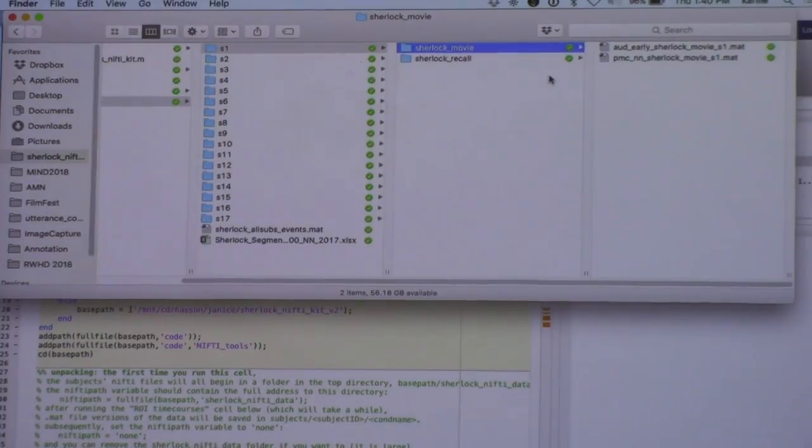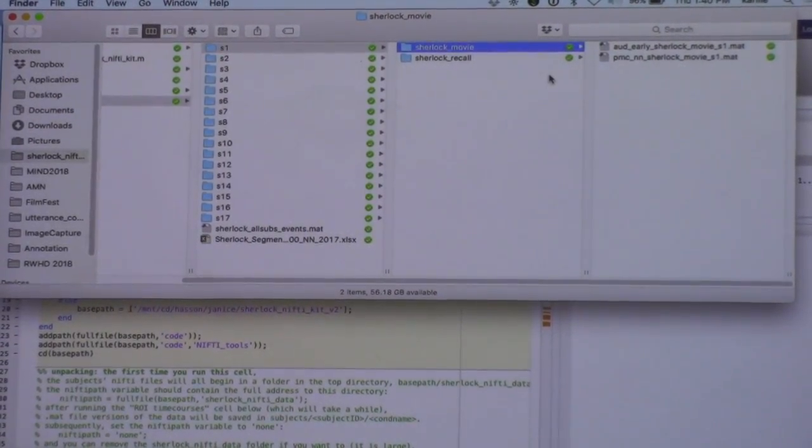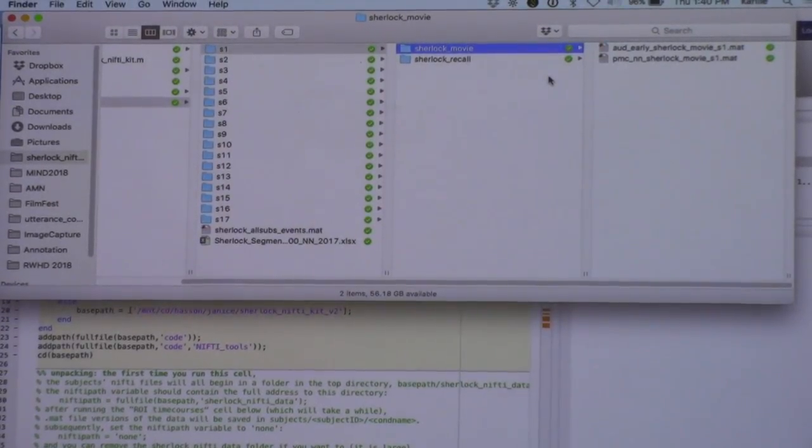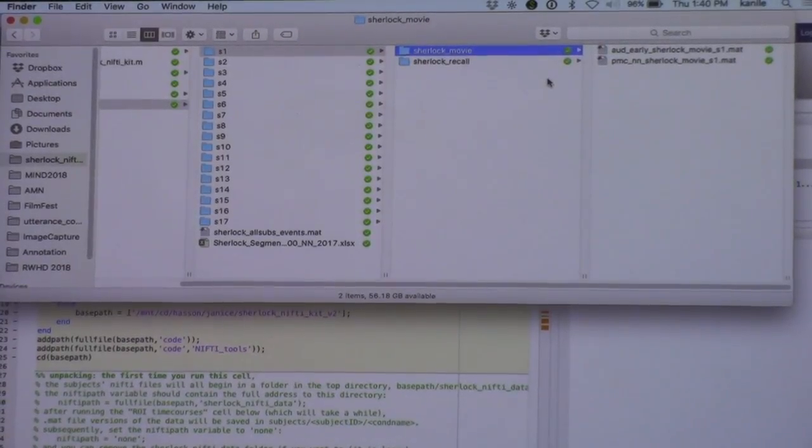All from the HRF, right? All subjects are shifted 3 TRs to account for the HRF. And the way that we determine that, 3 TRs is 4.5 seconds. And we determine that by taking the auditory envelope of the stimulus, and then we take the response in early auditory cortex, and then we do a cross correlation and find the peak match.